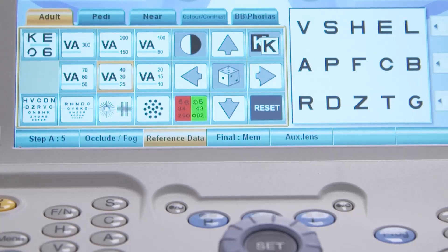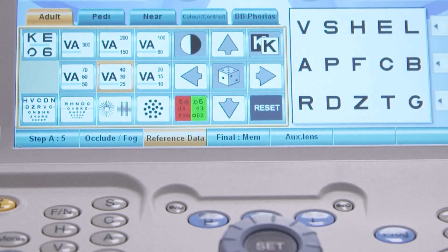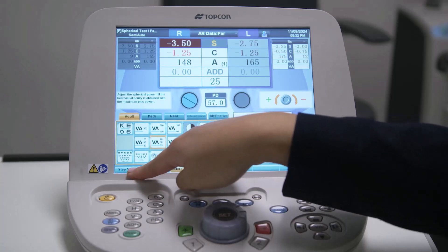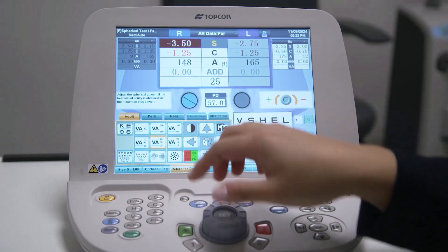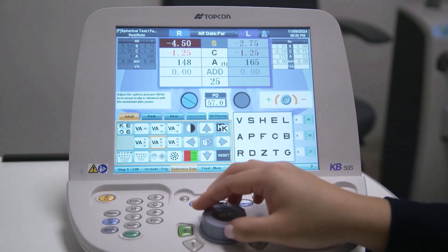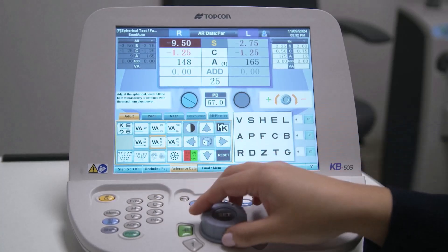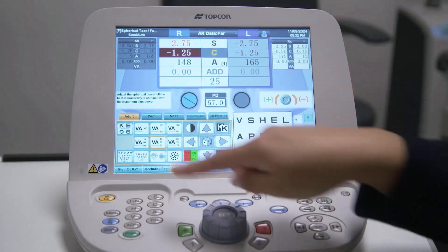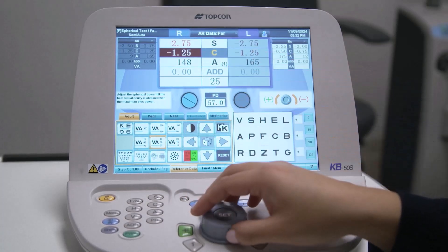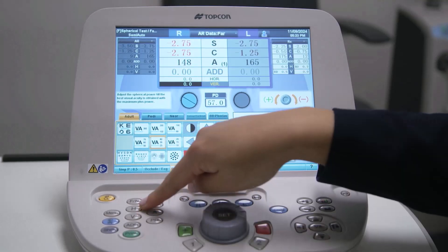The function bar is at the very bottom of the screen. The functions displayed change according to the test being performed; however, these are the most commonly displayed buttons. Starting from the left is the step size adjustment, which alters the increments by which a particular value changes as the dial is turned. You can change the step size for sphere, cylinder power, cylinder axis, and prism.